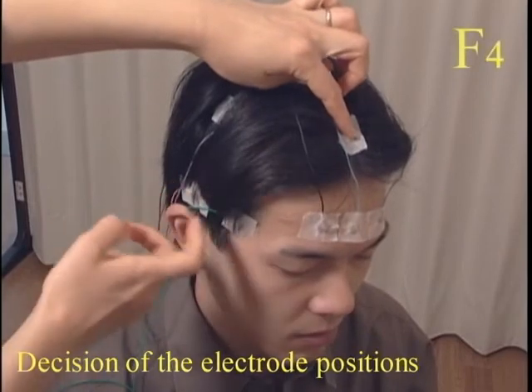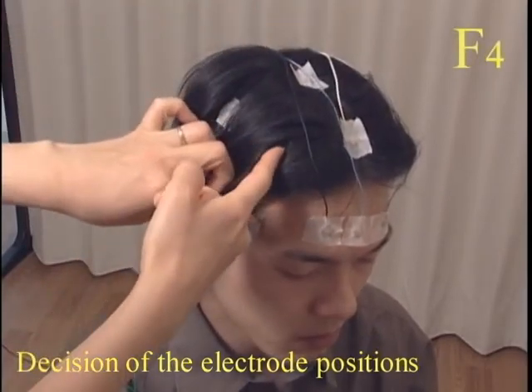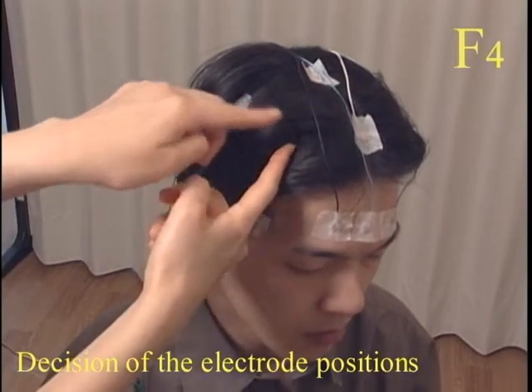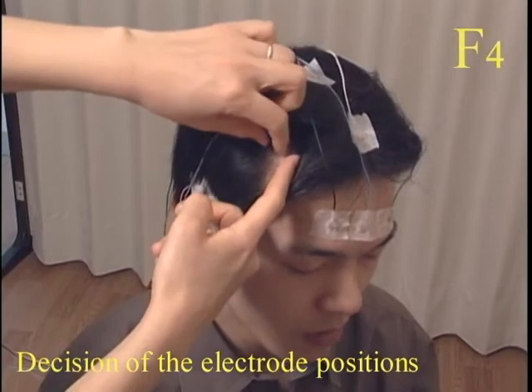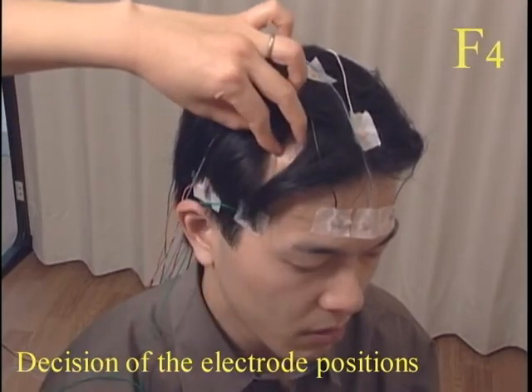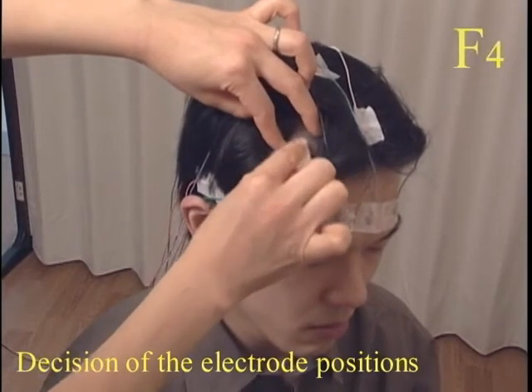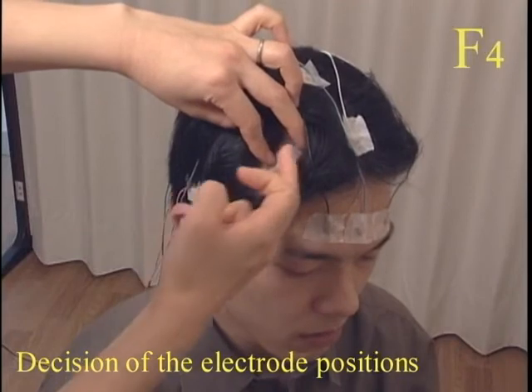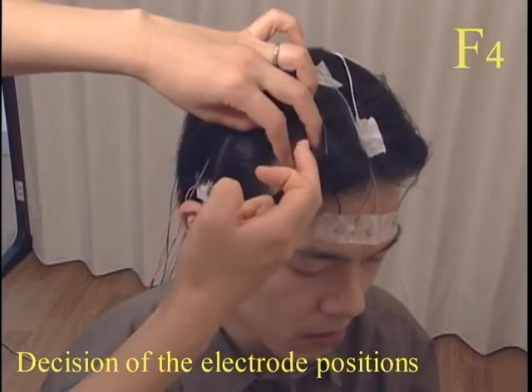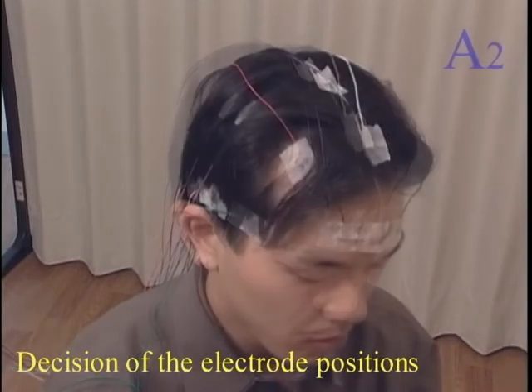F3 and F4 electrodes are applied in the same manner as P3 and P4 electrodes. In other words, F4 is the position equidistant from FP2 and C4. If the distances to the original F8 and FZ are equal, then the electrode has been placed properly. Apply F3 by the same methods. This completes the anterior electrodes.